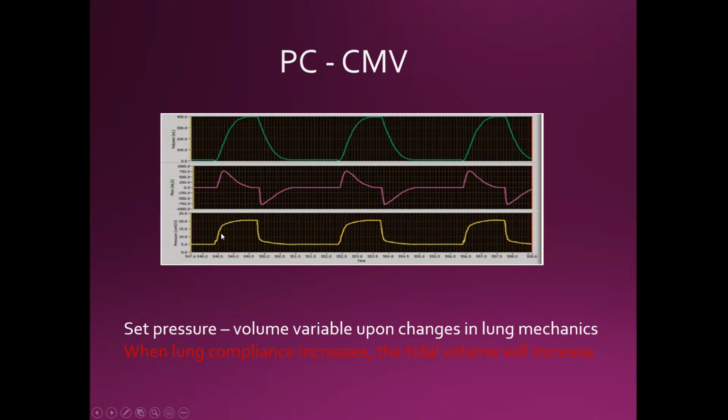So when pressure starts to go up, you start noticing the volume starting to rise, and then your pressures start going up, and then, I'm sorry, this is your flow. The flow starts going up, but then it starts to kind of go down, and then right when the pressure stops, the pressure starts dropping, flow drops. So this is you exhaling, and then your volumes are starting to go down as you exhale.